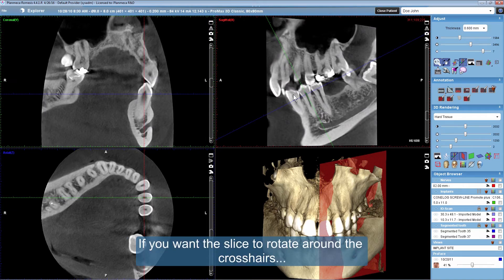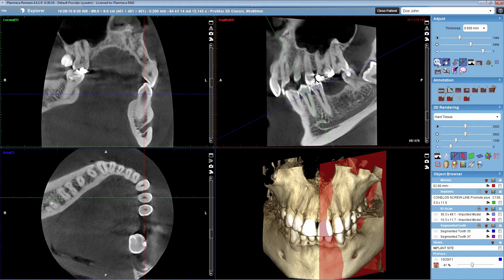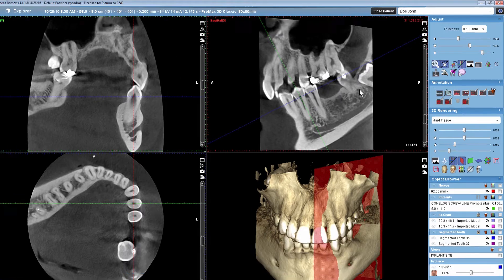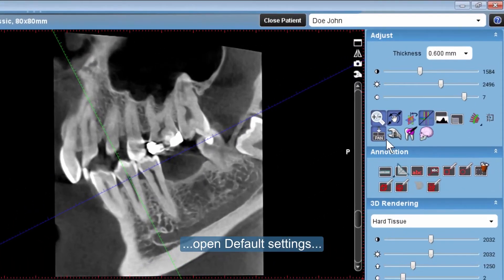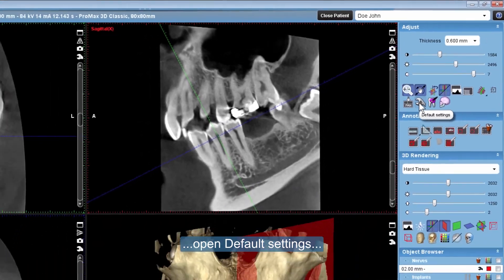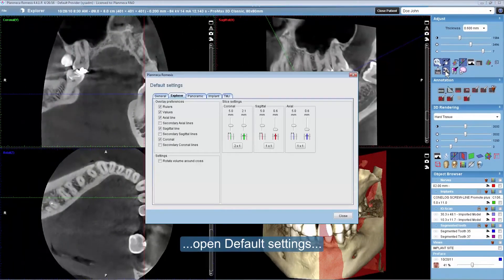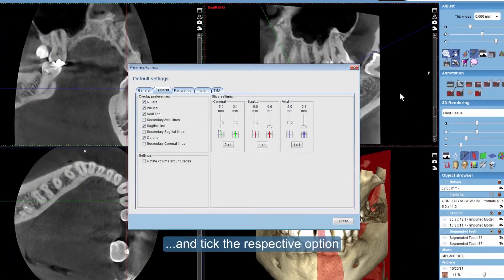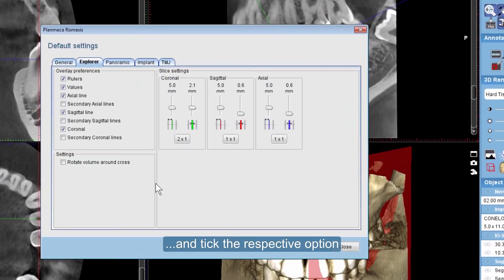If you want the slice to rotate around the crosshairs, open the default settings and tick the respective option.